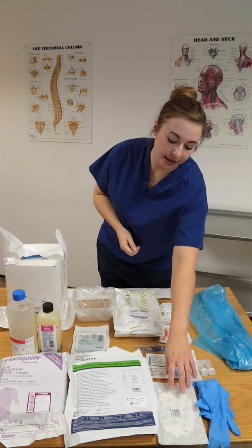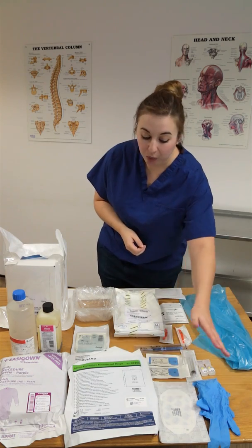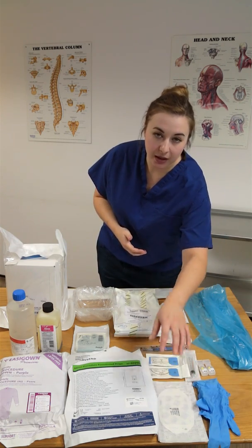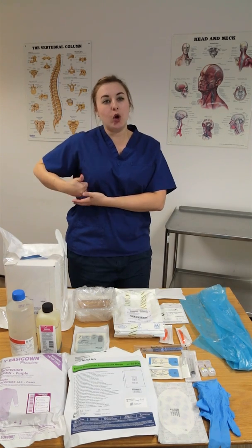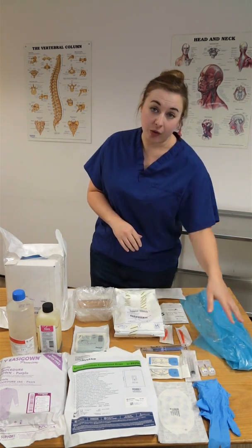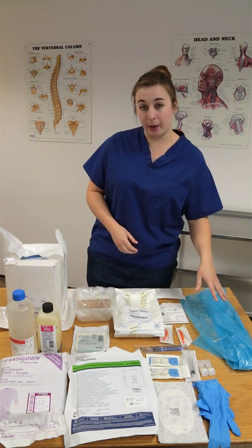The last couple of items you'll need are two clear adhesive dressings — whatever your trust stocks, whatever you prefer — to go over your sutures and anchor your chest drain more securely in place, also covering where you've made the wound. And finally, your own PPE for when you're assisting: a pair of gloves and an apron.